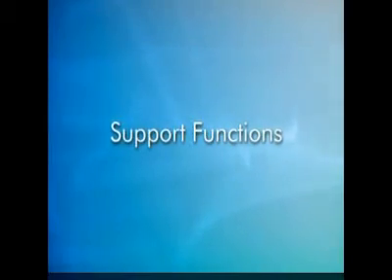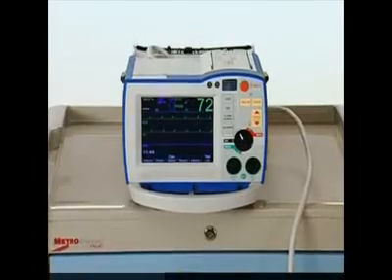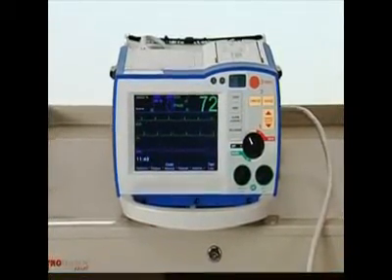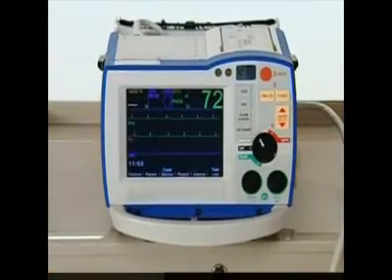Support functions. The R-Series includes a number of functions that make it easy to use and ensure that the device is always ready. Let's start by looking at the strip chart paper and the types of reports you can access and print.